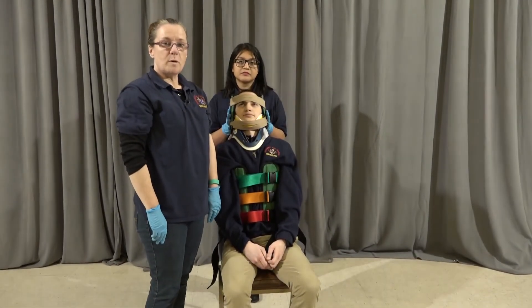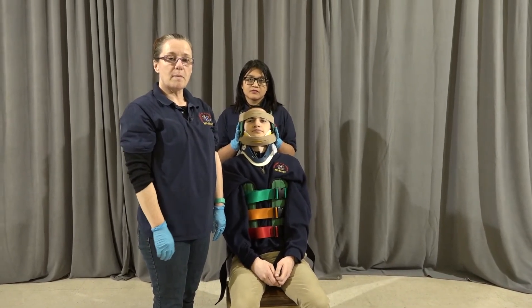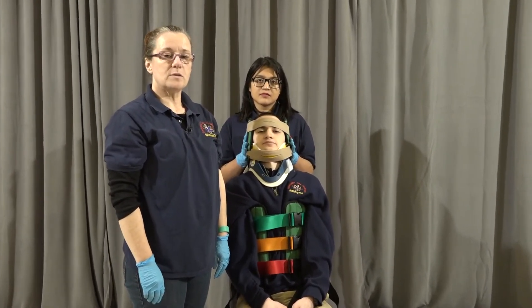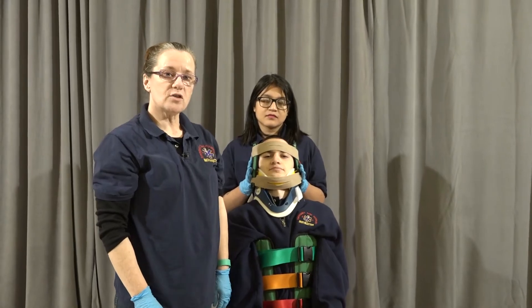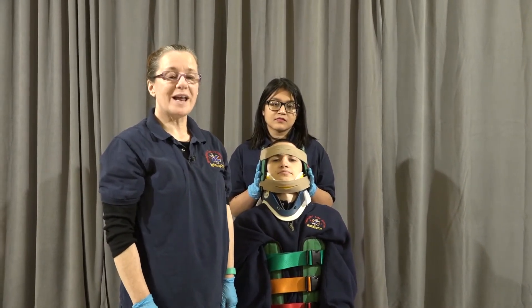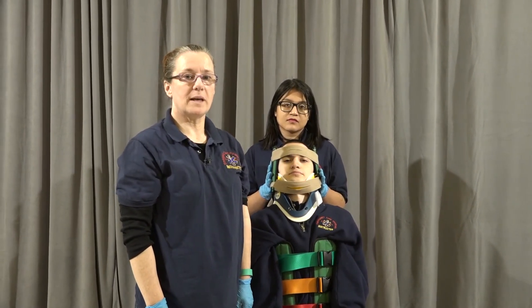I'm now ready to move my patient. I'm going to secure them onto a backboard first and then move them to the stretcher. Once on the stretcher, I'm going to remove them from the backboard and the KED and leave the collar in place.